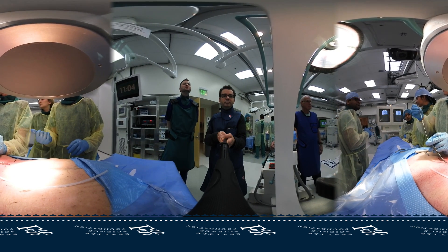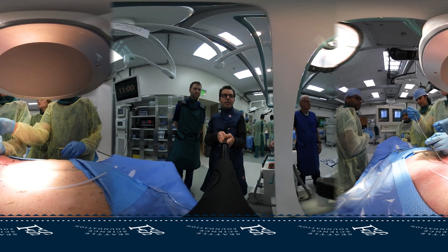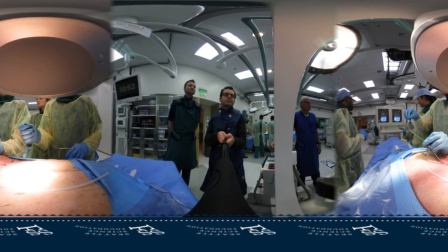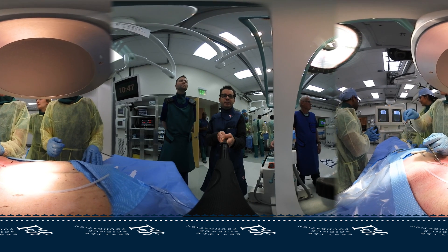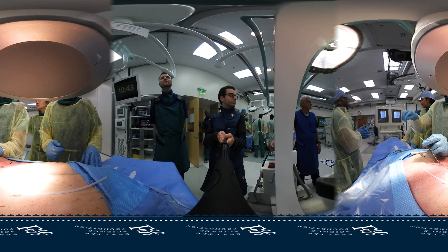There's resistance here. So now what you do is kind of spin that and lead a little bit — like 180 degrees — and then try to advance. Tell them to get passes. You will find a way past. There you go, good.